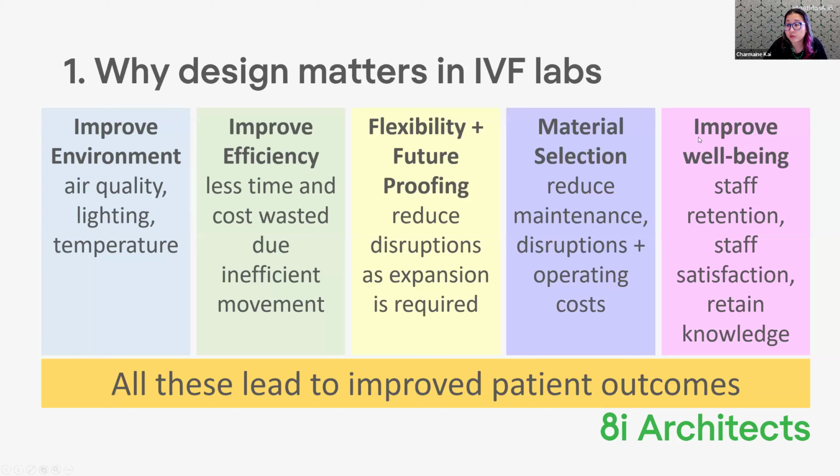The other thing is to improve the well-being of the staff. So it's really important. Having a lab that's actually designed to cater for the comfort of the staff, you'll actually see the benefits in terms of staff retention. You know, staff reducing burnout, they'll actually want to stay if it's a lovely environment for them to work in. They'll have an increase in staff satisfaction.